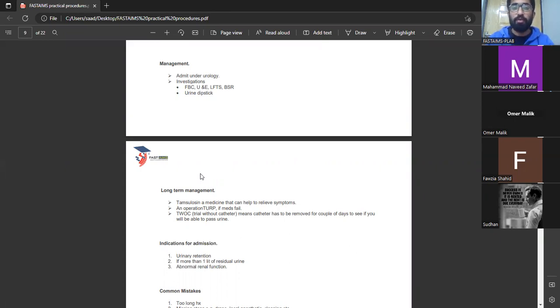Okay, so the examiner would give you findings: abdominal distension and enlargement of prostate. I can see that you are having urinary retention, and you are having the pain because of this. You are unable to pass urine, you are having pain because of this. So to reduce this pain, I need to pass this thin flexible tube. So it would not be painful. I will be giving you numbing agent. Can I proceed? Okay, prepare your equipment, divide in 4 steps: cleaning, draping, kidney tray, and then urinary bag.